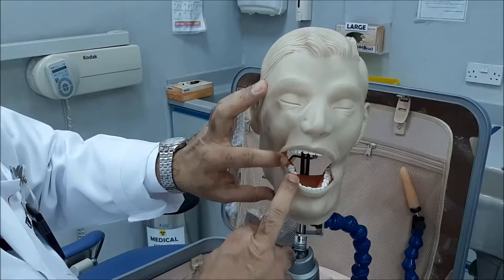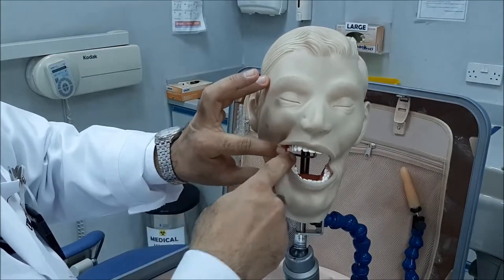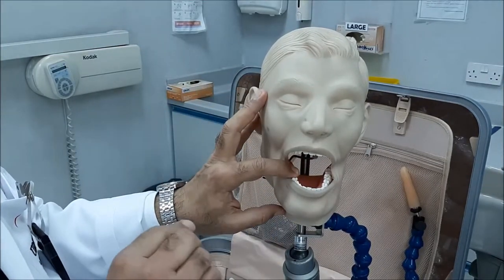When you're going to do a bite-wing radiograph, you do it for the premolars in a single film and for the molars in another film. Don't mix between the two.